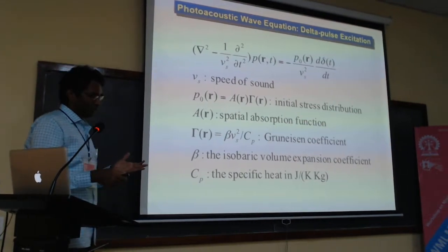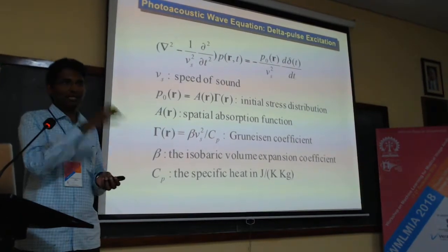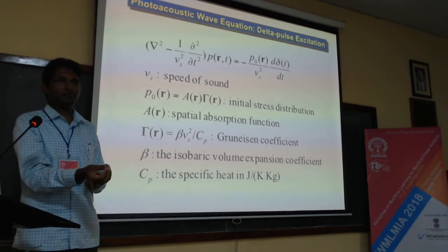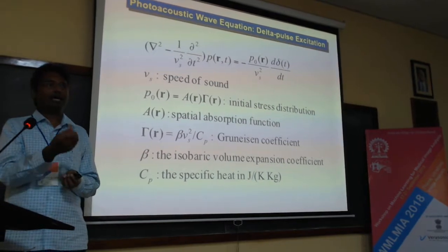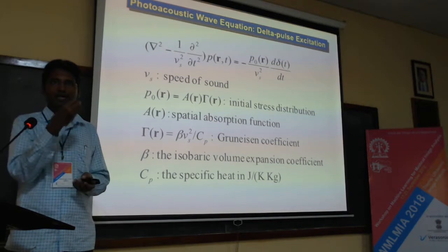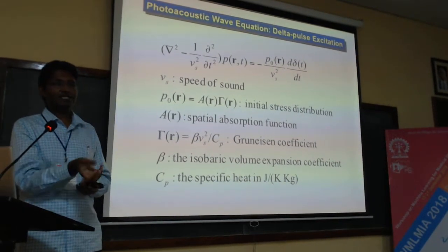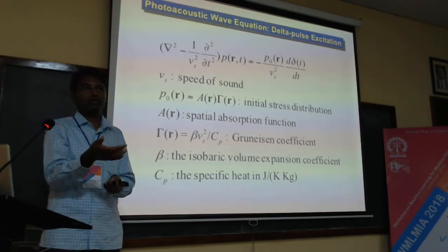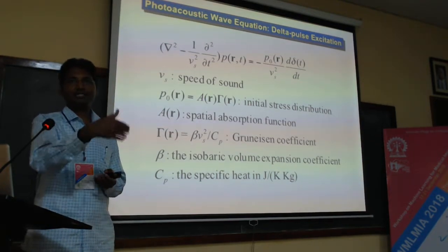Till now we have only been talking about signal generation. I sent the laser, it has been absorbed by the tissue, and because of the absorption there is a thermoelastic expansion, which obviously has effects on the thermal diffusivity and so on. Then it has expanded and generated that sound waveform. Now that sound wave is going to propagate through the tissue before it goes to the detector, because as I told you, we always keep the detectors at the boundary of the tissue, and we are interested in detecting at the boundary of the tissue.